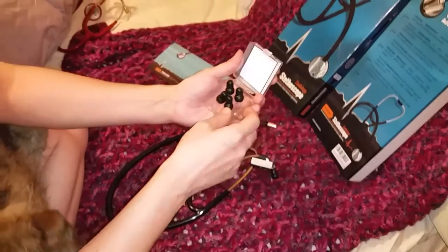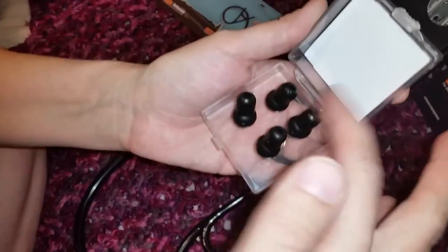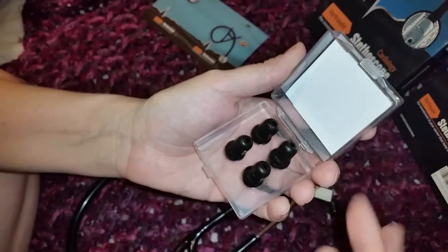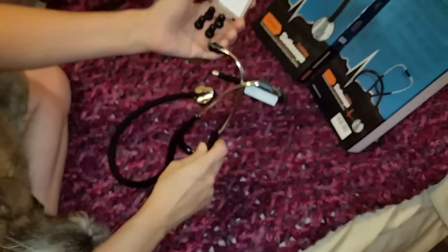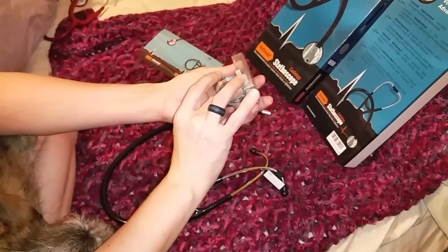It also comes with this case with replacement earpieces. So if they don't fit quite right, you can swap them out. It also has a replacement diaphragm.